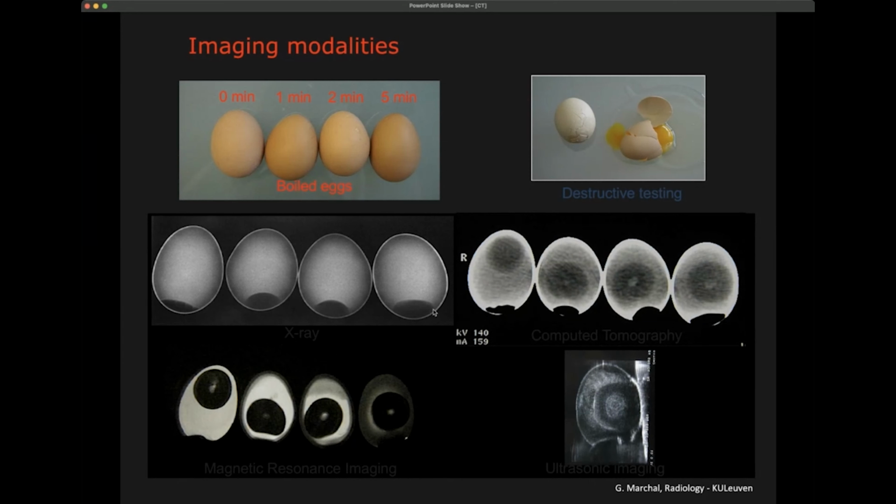Now, in the first class, we talked about these images here. These were the regular X-ray images. These are projection X-ray images, where you have the source at one side, and then you let the X-rays pass through the object, and then you have a detector that will make the image. So that means that you don't have a tomogram, so you don't have cuts through it, but you can see inside. So you see the different types of tissue that are there. And what you also see is that these are reasonably crisp images. So they actually have a very good resolution, which is isotropic. So in the X and the Y direction, you have the same resolution.